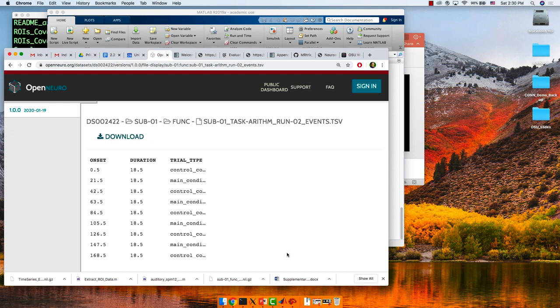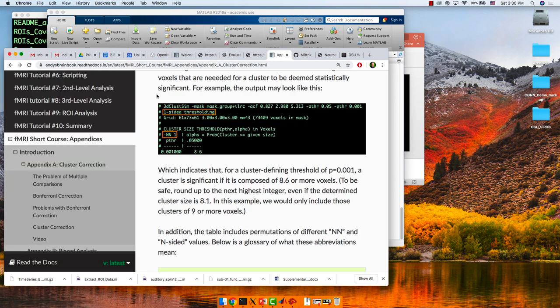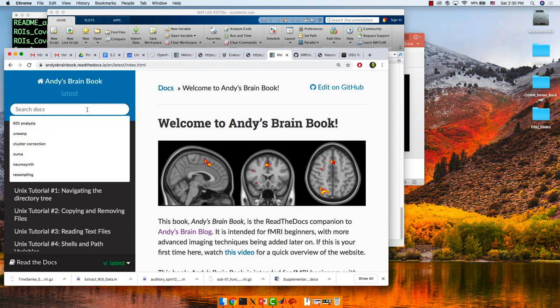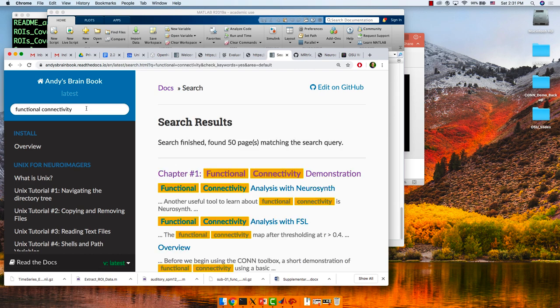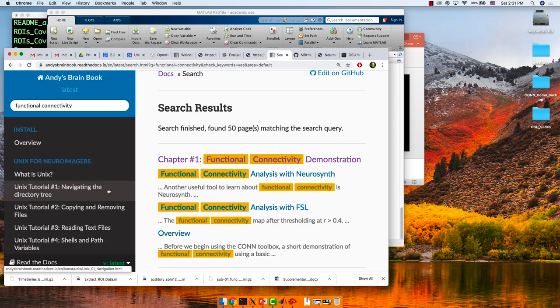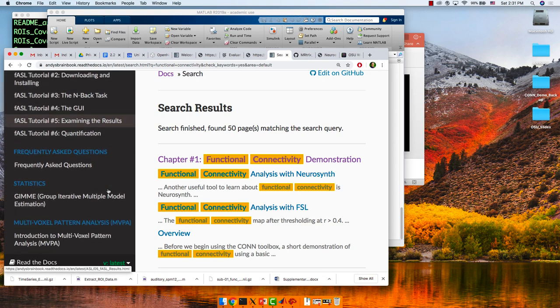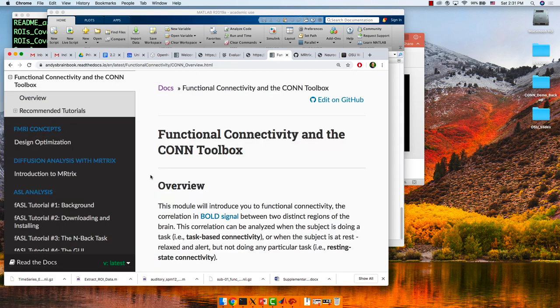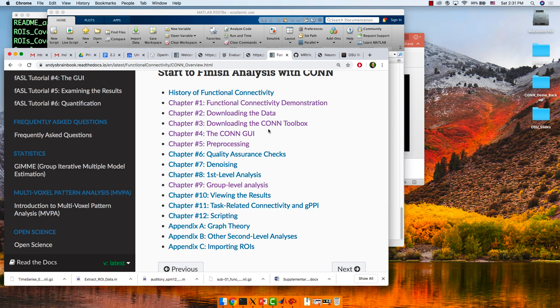If you have the Brain Book tab open, go back to that. You can scroll down to Functional Connectivity in the CONN Toolbox. There are code snippets on this site that I'll have you copy and paste into your MATLAB command line. Click on that and scroll down to downloading the data.